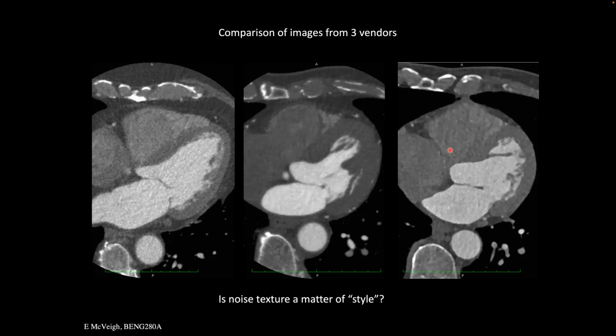But also, if they give us the raw image, I feel like that's a better way of judging. You're not giving us the raw image. That is an excellent point, and that could be one reason to abstain from voting, because the question may be loaded, or not important, because by the time they're finished with this image, Lord only knows what the point spread function is, right? Now you could test it on lots of phantoms and things like that to find that out.